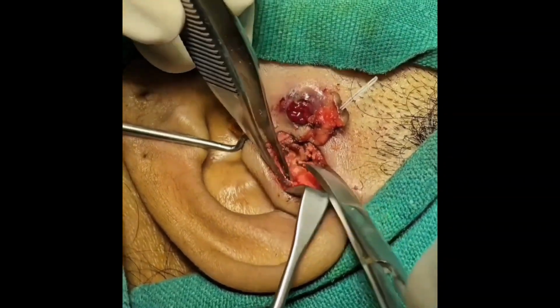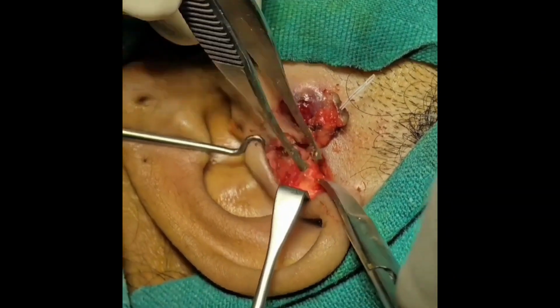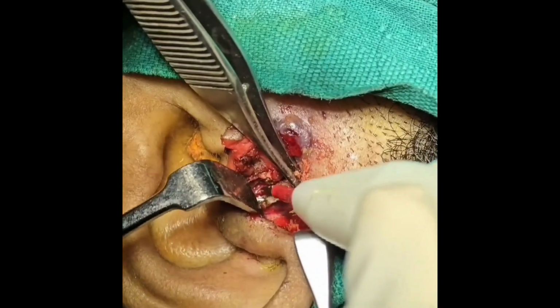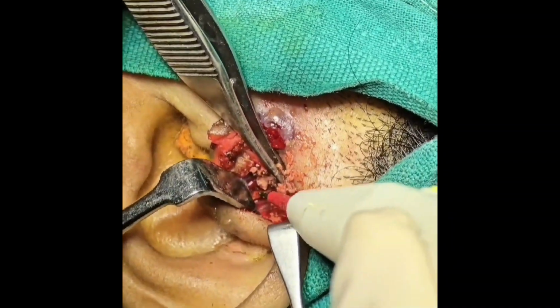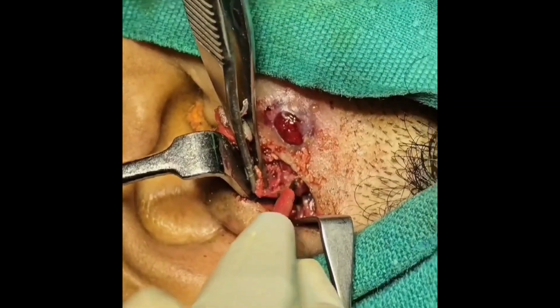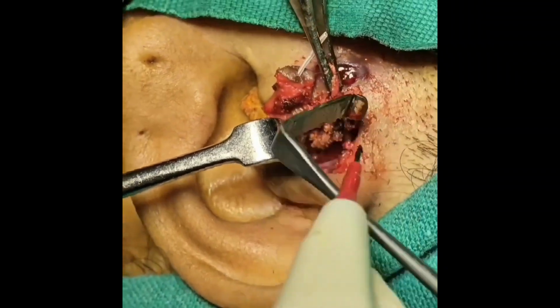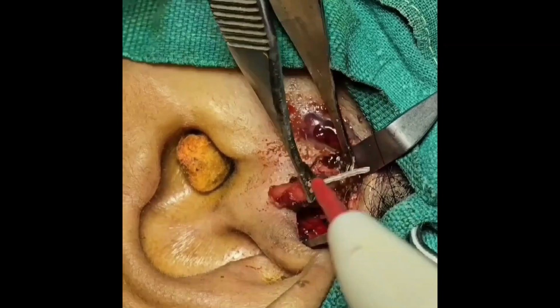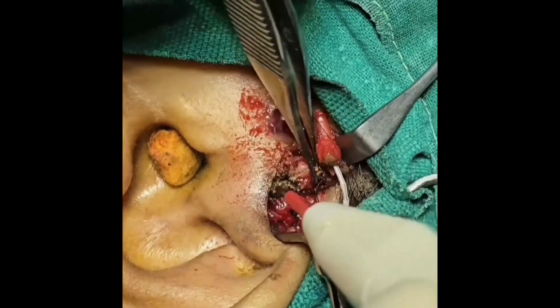So in my case, the tract has already been amputated accidentally because I opened the tract. So you can see the residual part of the tract deep inside, and I am excising that. I'm using the monopolar cautery and carefully cutting the subcutaneous tissue, whatever is there.